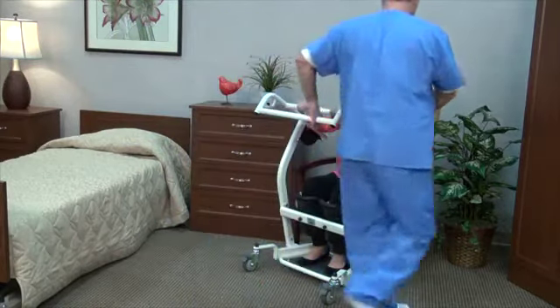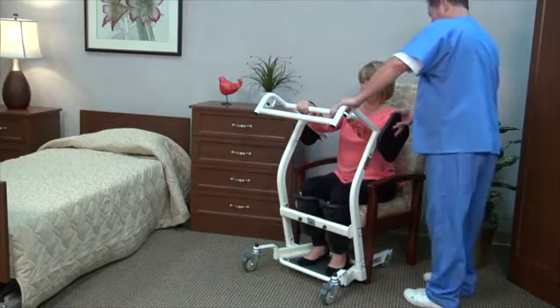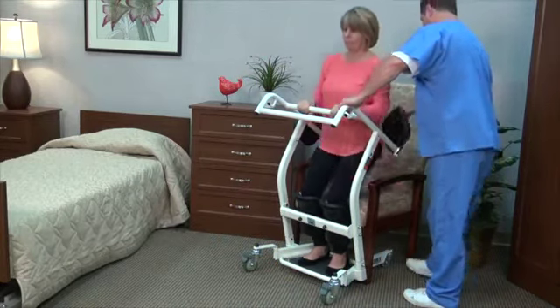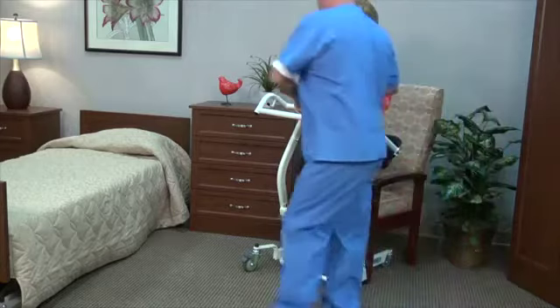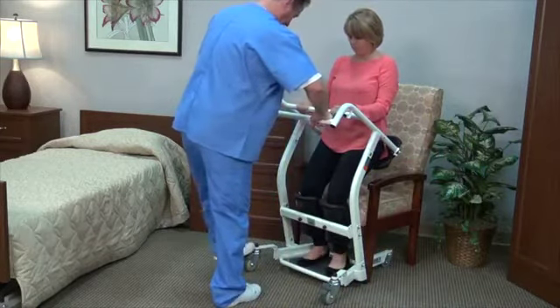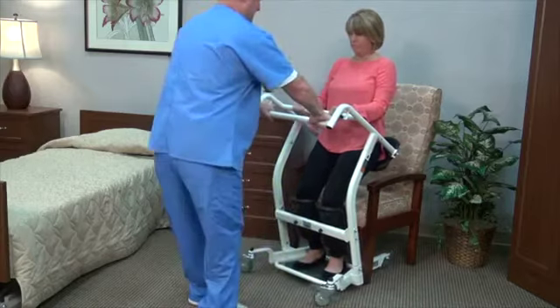Have the resident step on the lift and pull themselves up to a standing position. Unfold the seat cushions. Have the resident sit and hold the handrail during transfer. Lock casters and reverse the procedure when the transfer is complete.